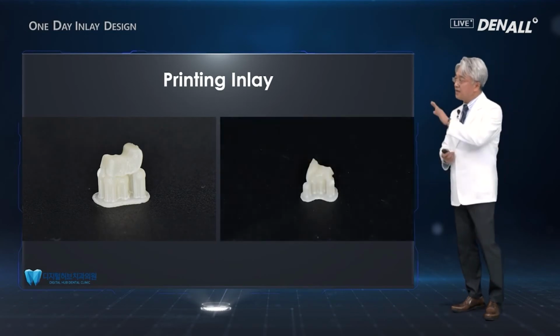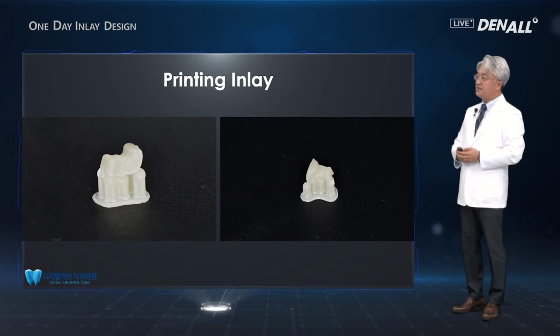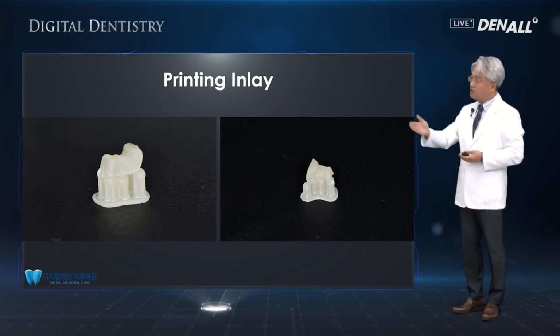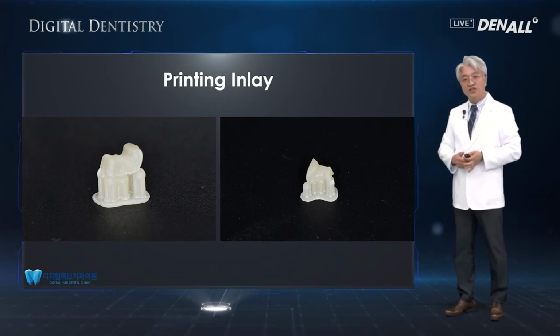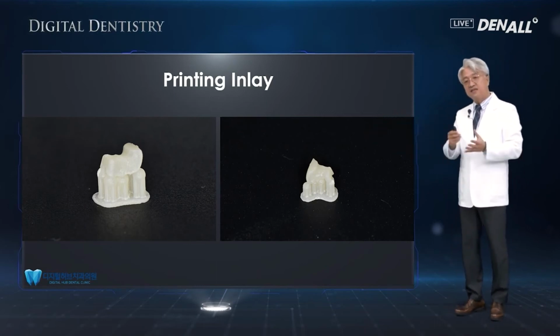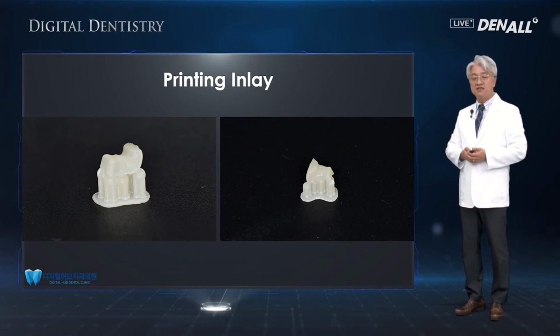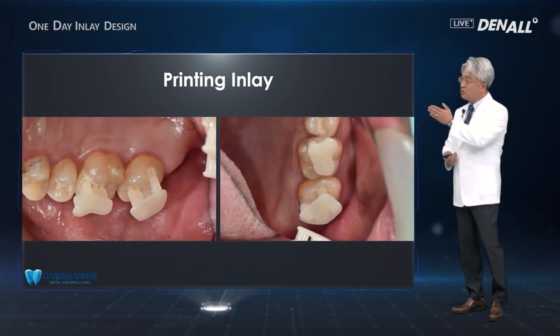Now, this is the 3D printed inlay, after all the processing is done, just before we deliver to the mouth. As you can see here, the margin precision is really good, but the fit in the mouth for the patient is currently being improved. So let's look at that.